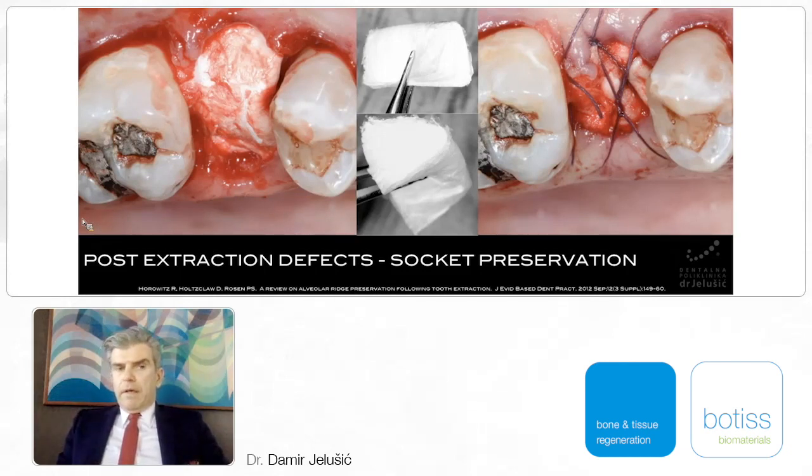The aim of a collagen sponge is not to protect the alveola for 4 months like a membrane. It's just to help the stabilization of particles in the first 2 weeks, and after that the natural healing starts as in every empty alveola, but with one very important advantage.